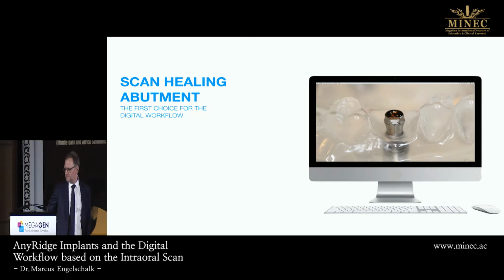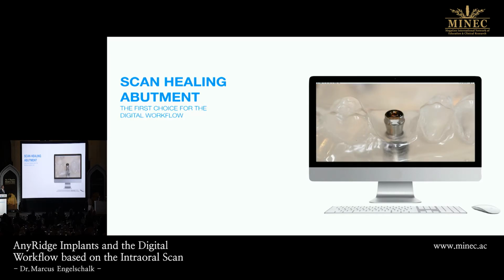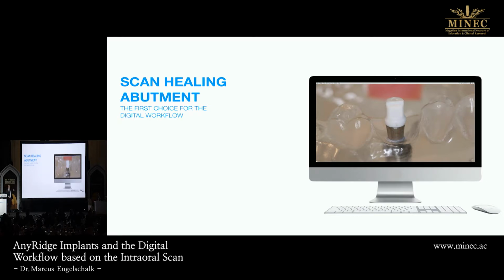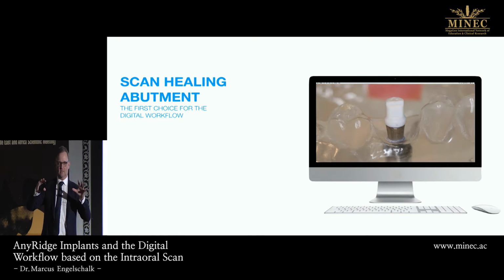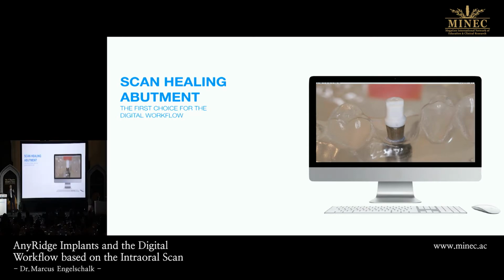It's very easy. You see there's something changing. This is the healing abutment, and now we just click something on it. And the thing we click on it will transfer all the data of the implant. And this will reduce the number of screwings because we count again together.